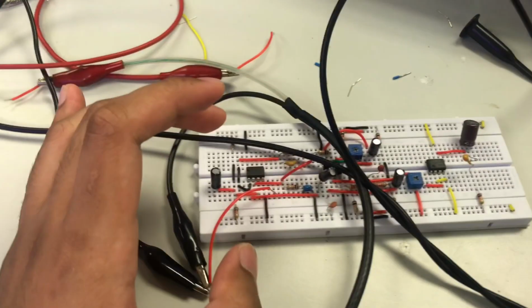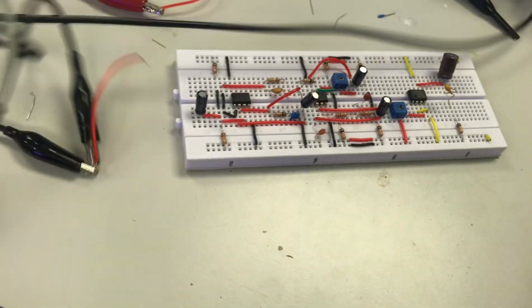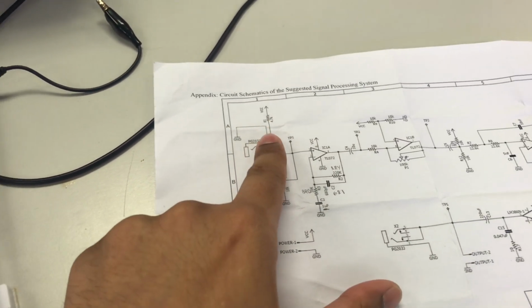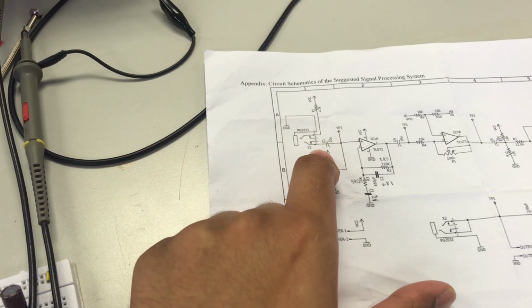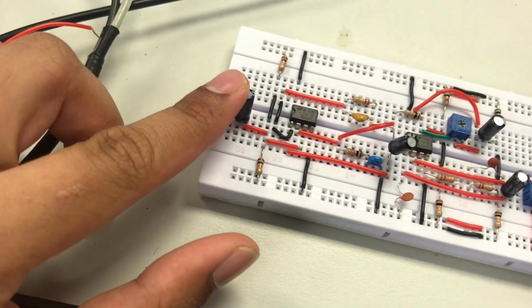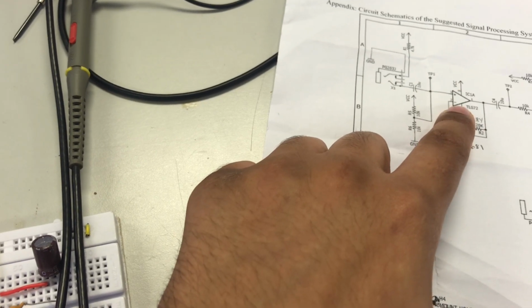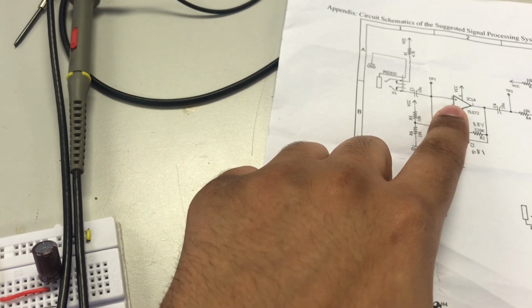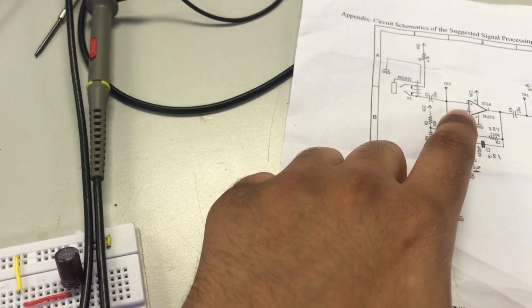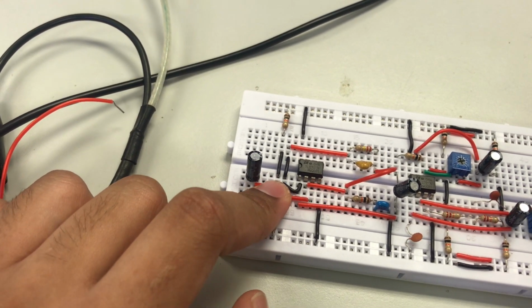So what I basically did on my circuit is, since there is an audio jack here and there's some components here as well, I'm planning to cut this off and start to do the patching from C1, which is a capacitor, which I've started here. So from the capacitor it will be connected to the first op amp, operational amplifier, which is a TL072, to pin 3. This will be my first test point, which approximately will be here. Yes, this is my first test point, TP1.